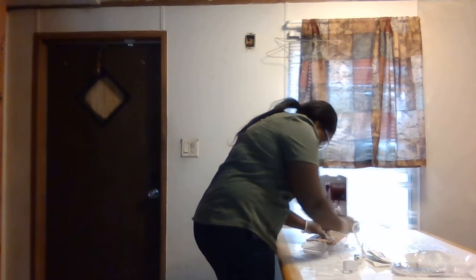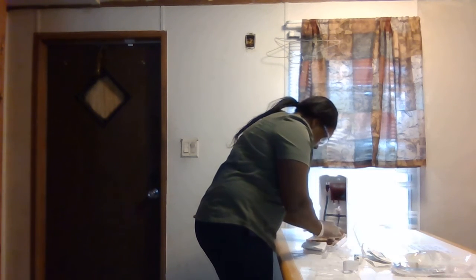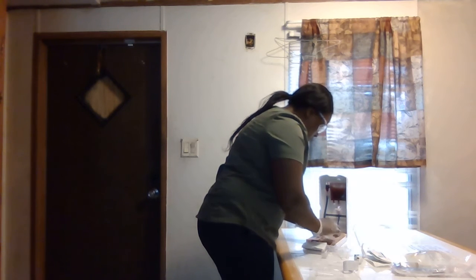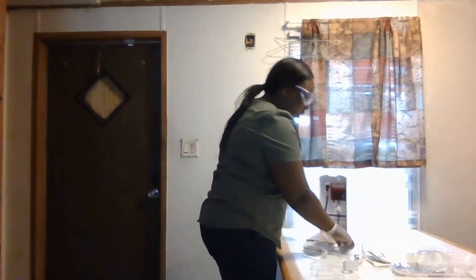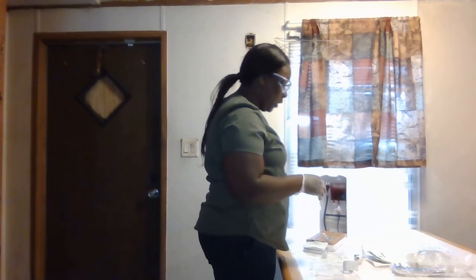So I'm going to go up under and kind of crisscross it, so to speak. Okay, again, then the second piece kind of just comes down like so. Okay. Again, this goes in my sharps. It's secured with my Tegaderm. I secured it with tape.